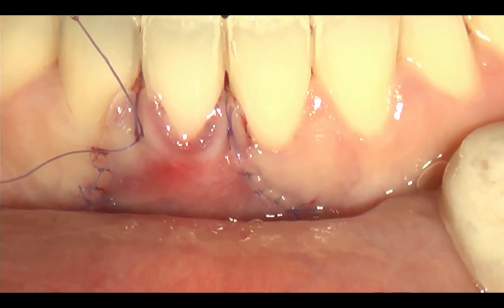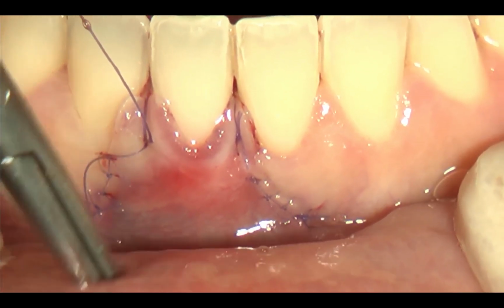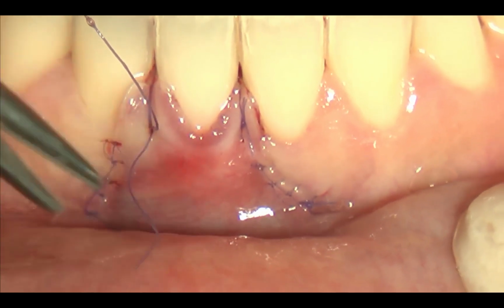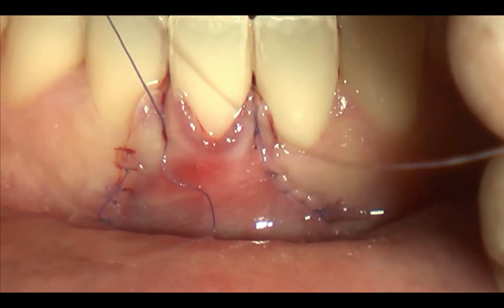Otherwise, if there is some small bleeding getting out, it means that I have to pull it a bit more. And that's why I cannot use a monofilament here, and the risk is to cut the papilla.